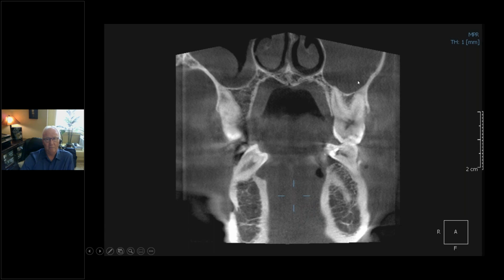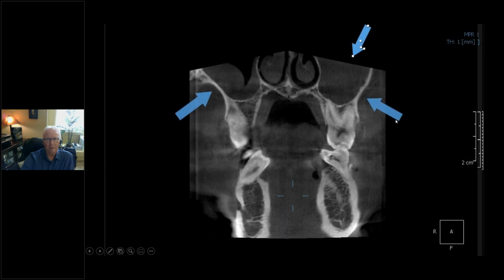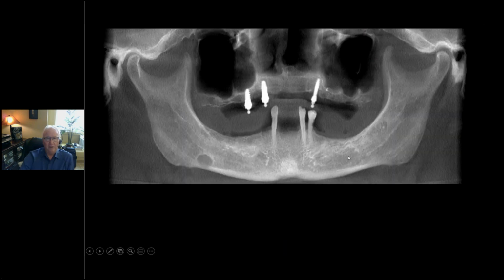So you have a diagnostic responsibility, or a clinician's obligation, to refer or re-image and see what the rest of the sinuses look like: the ethmoids, the sphenoid, and the frontal sinuses. You don't have to re-image, you don't have to make the diagnosis, but you have to recognize the change and refer it properly.